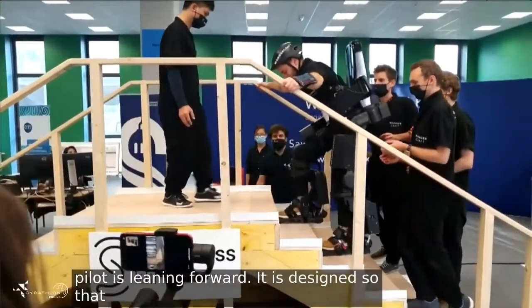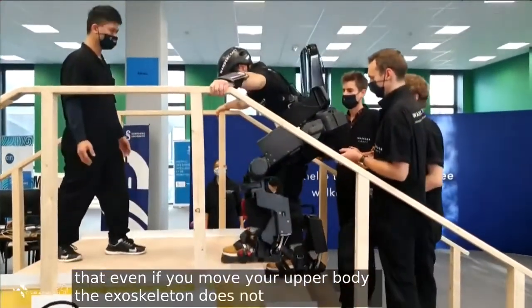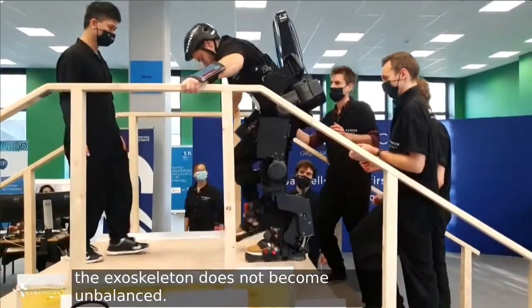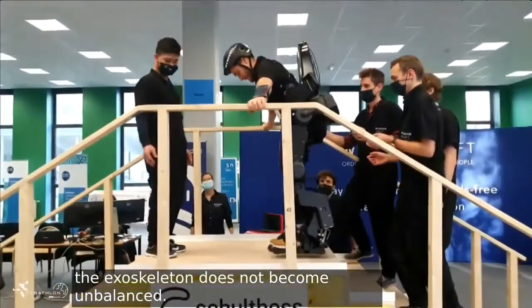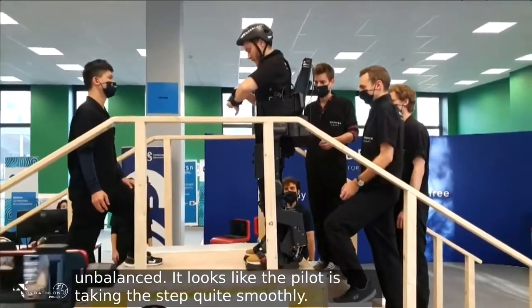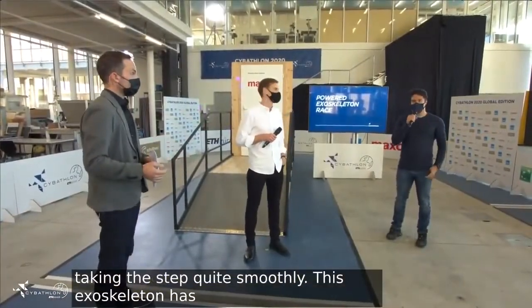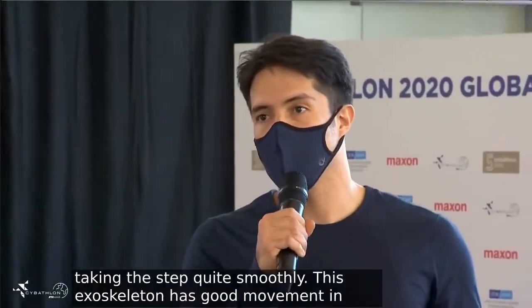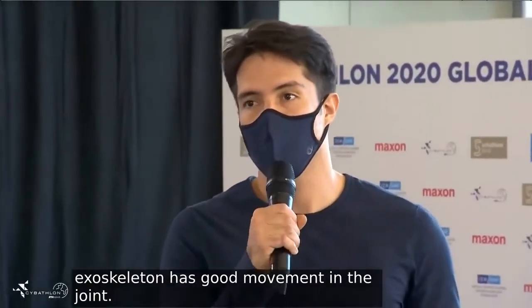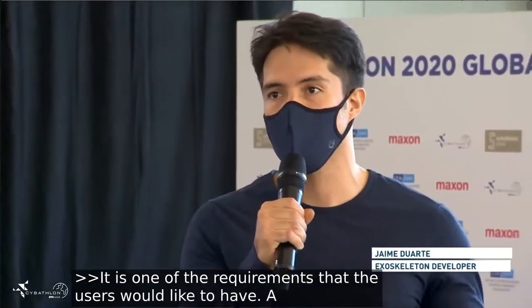And also for walking, you see it now — when the step is done, it looks quite smooth. This is because it has more motors, also in the ankle joint and knee joint, and in different directions. Is this the future of the exoskeleton without crutches? For sure, it's one of the requirements that users would like to have, because a lot of them complain that if their hands are full, they're not able to interact with objects in daily life.